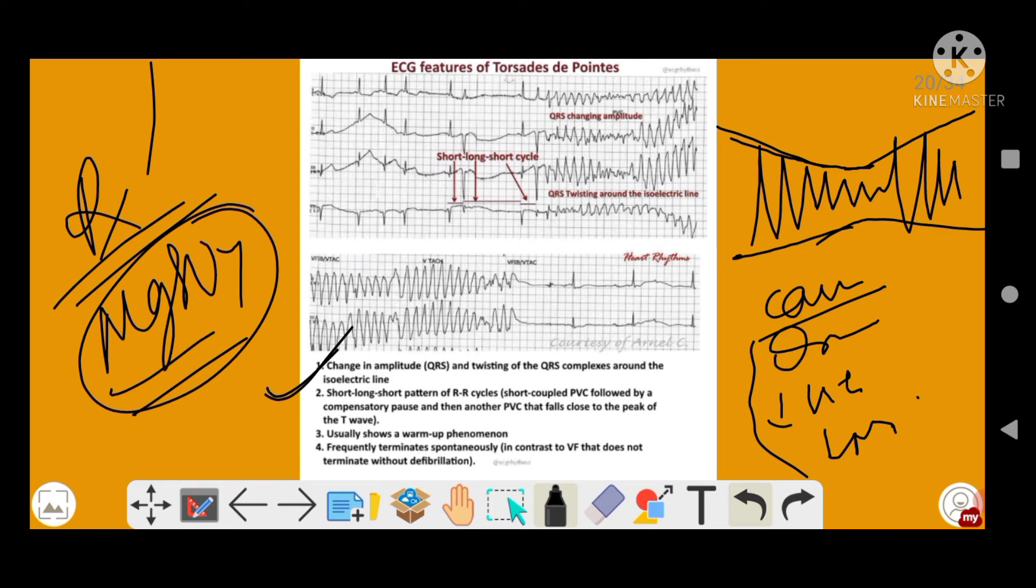Now, short-long-short pattern of the RR cycles, as I mentioned. And usually there is a warm-up phenomenon, and frequently it terminates spontaneously. Anyway, the first two being the characteristic of your torsades de pointes.